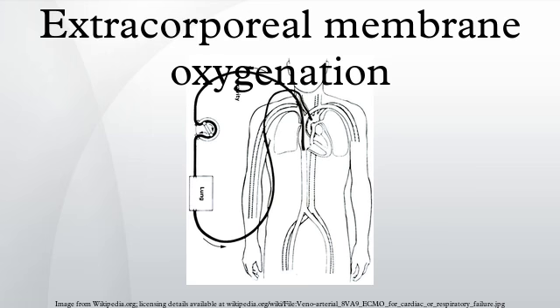Pulmonary hemorrhage. Pulmonary hemorrhage can occur in patients receiving ECMO. Cardiac thrombosis. There is retrograde blood flow in the descending aorta whenever the femoral artery and vein are used for VA ECMO. Stasis of the blood can occur if left ventricular output is not maintained, which may result in thromboses. Coronary or cerebral hypoxia. During VA ECMO, fully saturated blood infused into the femoral artery from the ECMO circuit will preferentially perfuse the lower extremities and the abdominal viscera. Blood ejected from the heart will selectively perfuse the heart, brain, and upper extremities.